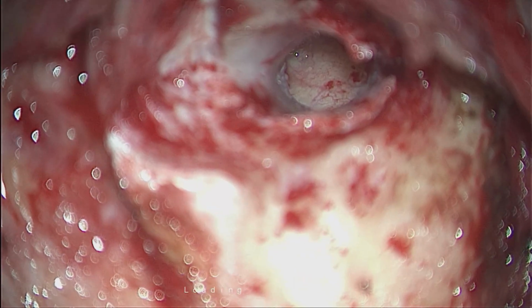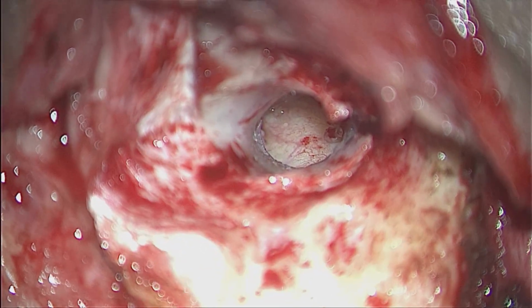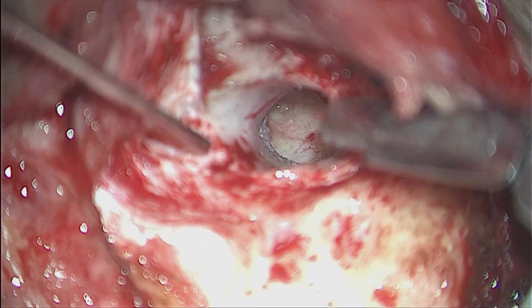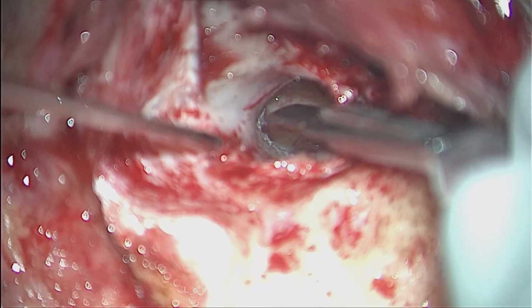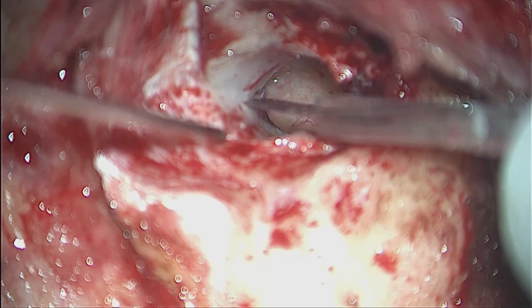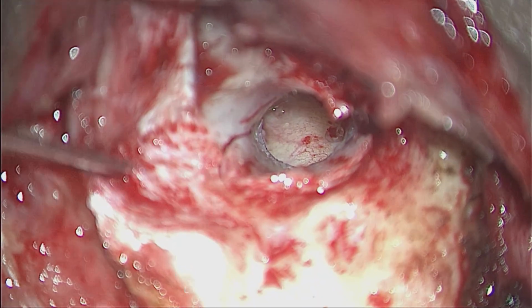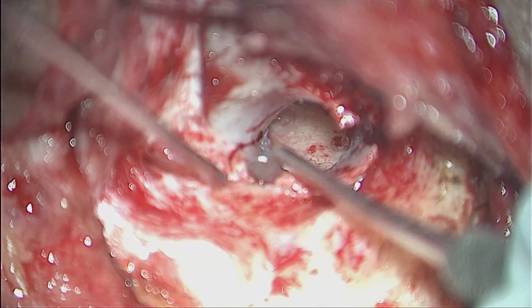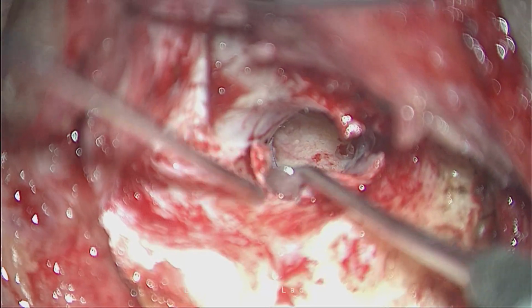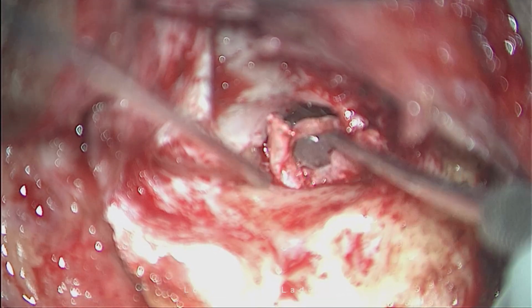So to make it easy, what we can do, I will make this incision a little bit limited. See, this is the inferior margin of the flap, this one. My inferior incision is a few millimeters beyond that, but not up to the level of the tympanic membrane. This is not a difficult technique, believe me. Everybody who has worked here has done this technique in numbers.